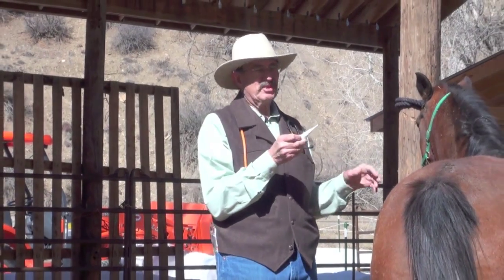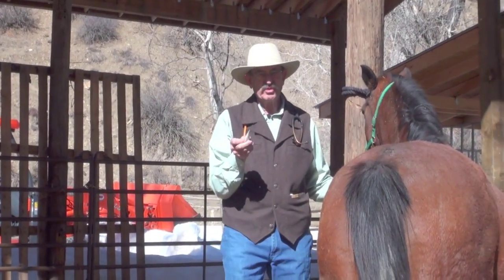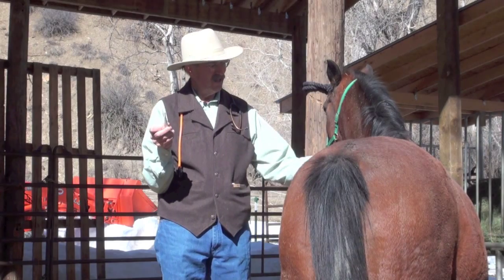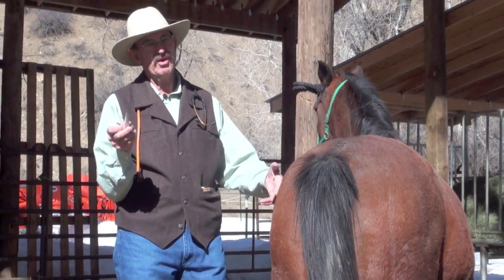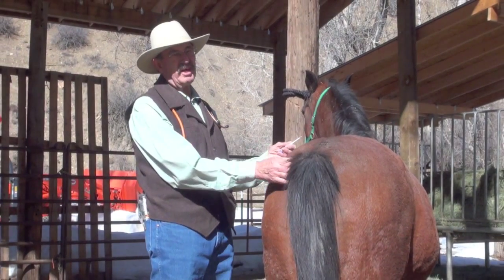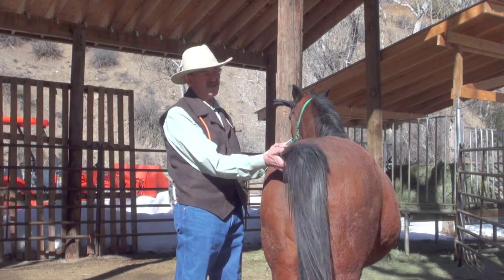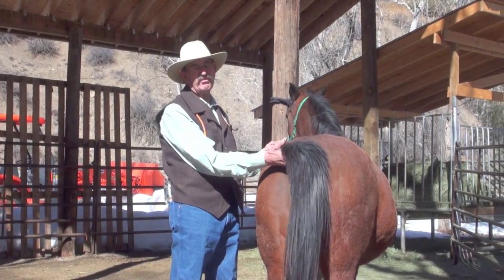The way I like to do it is to always approach a horse from the shoulder area, let them know that I'm here. Now this mare is going to be a little bit easier than many because she likes to raise her tail. You kind of ease yourself along the side, letting her know all the time where you are. If you've got a horse that happens to like tail scratches, reach underneath the tail, give her just a little bit of a rub, and they'll lift their tail up for you.